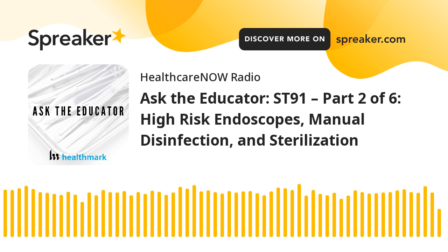And then for those that are non-high risk endoscopes, examples might be your gastroscopes and colonoscopes, you would do a statistically significant portion of your number of procedures. So it's going to be based on your procedure volume to figure out what a statistically significant frequency would be.